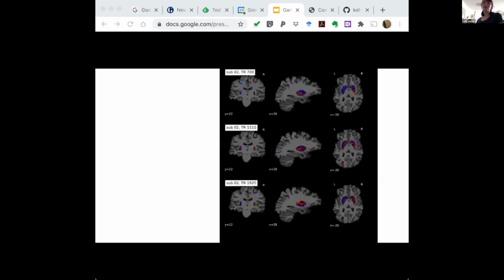Okay, so this is example CNR data from 1 participant over our 3 sequences. The brain is intersected so you can see across a few of the ROIs. Because for my question, I care about the magnitude rather than the direction of the difference, I'm going to extract the voxels from each ROI and compute the average root mean squared CNR for that region. And that's what I'll take you through now.